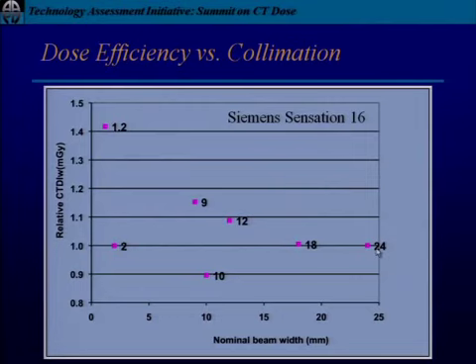These guys all follow a trend that you'd want, but there's this guy here, this 10 millimeter slice, that was incredibly efficient compared to everyone else. They developed that for the CT intervention practice, where a little bit of partial voluming at the edge of a 10 millimeter slice, where you're just trying to do interventional monitoring, there the lower dose was important.